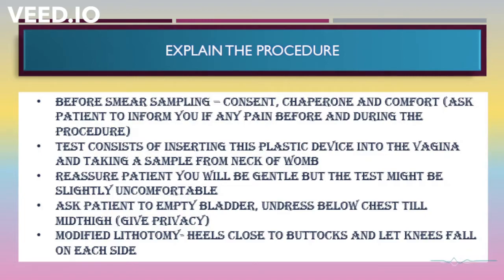And also inform the patient that this test will be consisting of inserting a plastic device. It's best to show the device to the patient into the vagina and taking a sample from the neck of the womb. Reassure the patient that you will be gentle, but the test might be slightly uncomfortable. Another point to be added is that after the test, the patient might experience slight bleeding, spotting. That is also normal.